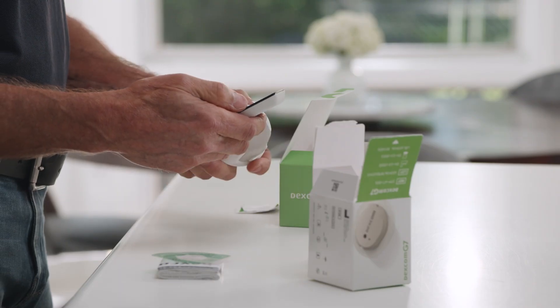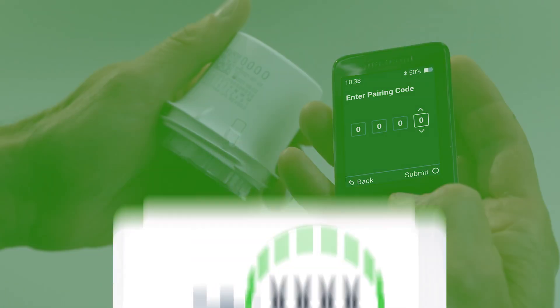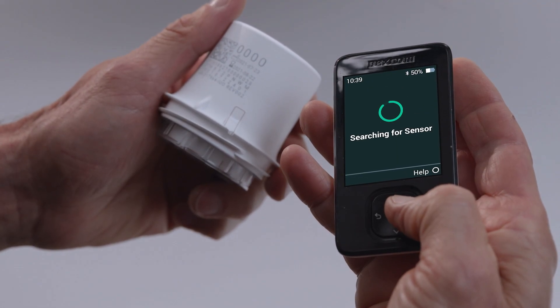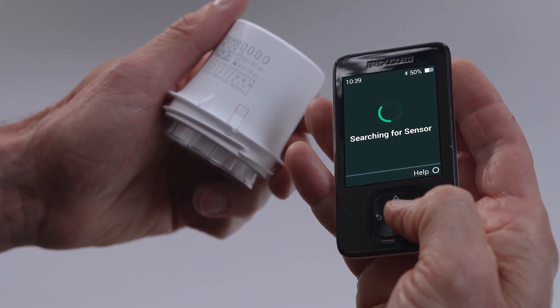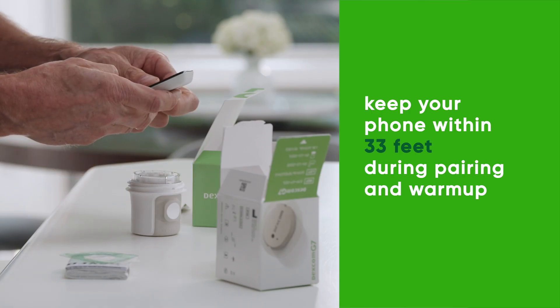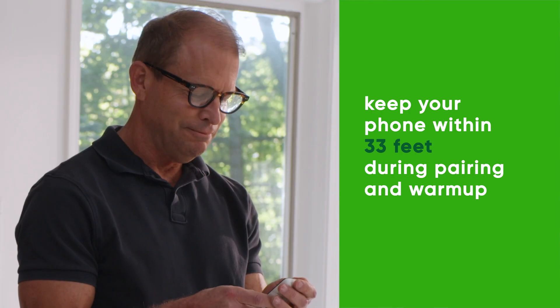Back on the receiver, select that your sensor is inserted. You will then need to enter the pairing code. You will find the four-digit pairing code on the applicator you used to insert the sensor. Wait for your sensor to pair. Once pairing is complete, select Finish and you will enter into your sensor warmup. The sensor warmup timer lets you know when you'll start getting readings and alerts.